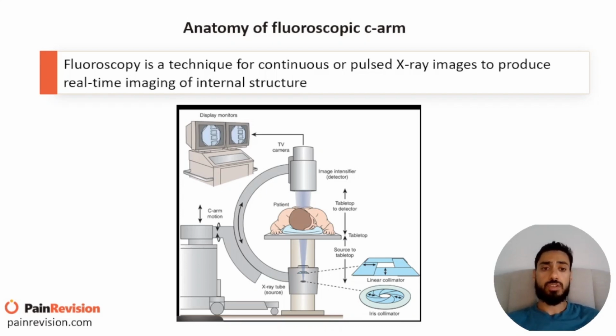It's a way of reducing the patient's exposure and your exposure. And you will see radiographers use this of their own accord. So if you think of it, if you're taking pictures of the lumbosacral spine, you're targeting the medial branch blocks, so you've got the vertebrae and you've got the pelvis, you will find that the radiographers might use the linear collimator so that you've only got an image of the bony vertebra and not of the background around it. And you could ask your radiographer to use the circular collimator if you wish, or the linear, depending on what you're imaging.